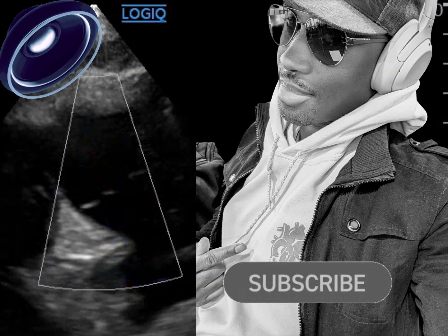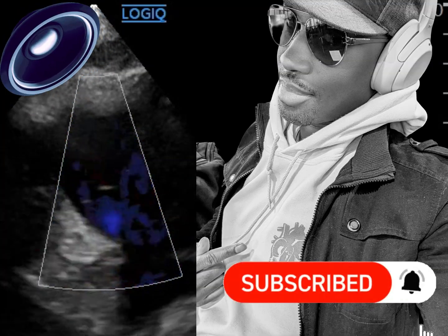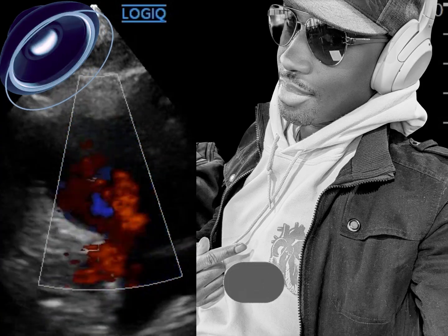These views and measurements are essential for understanding right-sided pressures, valve function, and overall hemodynamics.